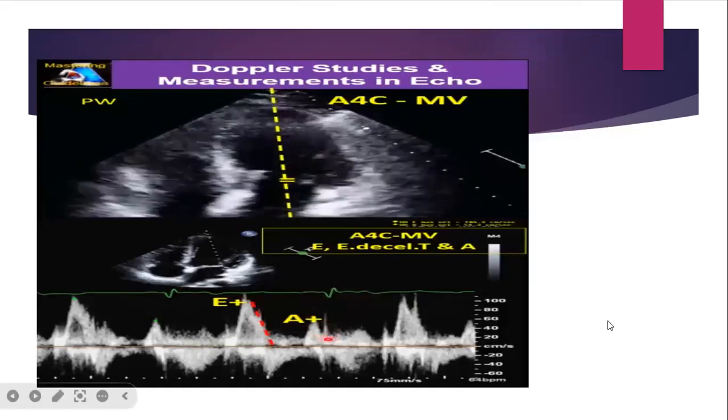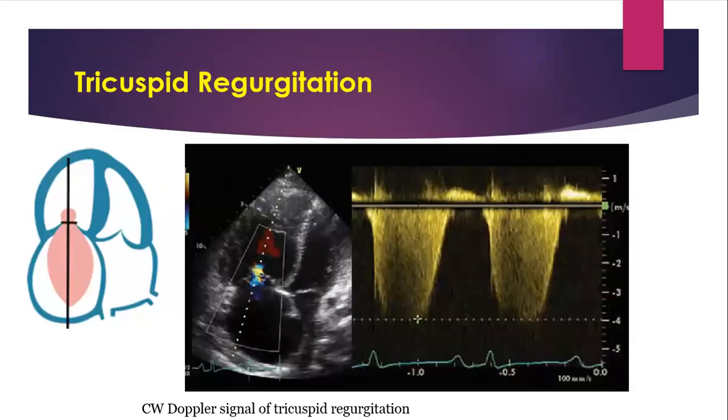Okay, you want to measure the velocities. Okay, the tricuspid regurgitations. Now, you should remember that if you want to measure the regurgitations, you use the color Doppler, where you check the blue and red. Remember the principle of blue and red: the blood which is moving away is blue, and the one moving towards is reddish. That one is very important.